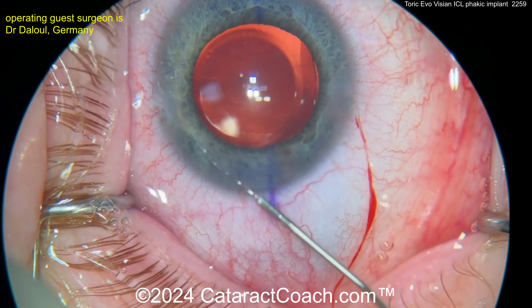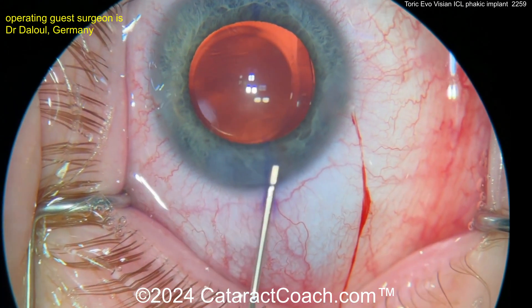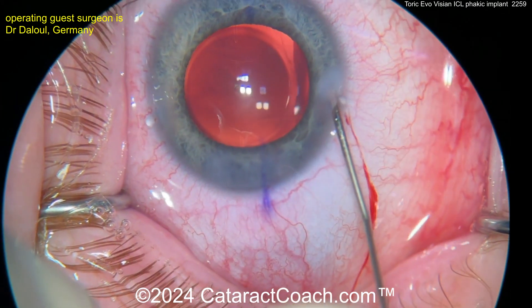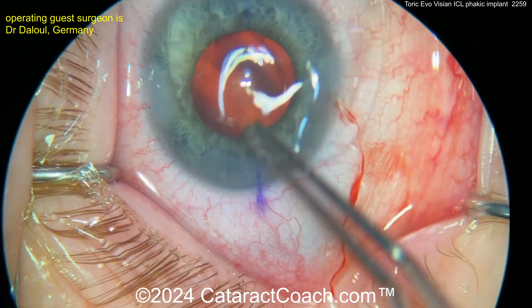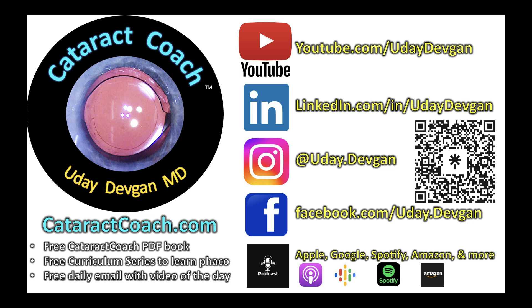This is a neat product and I hope to start using it more in my own practice. This may be a great option for patients who want reversibility — think about that. And remember, there's a new podcast every single week, including one coming up soon with Zaldivar, talking about how to choose sizing, his AI calculator, the accuracy, and just great pearls to learn. Let's learn together.